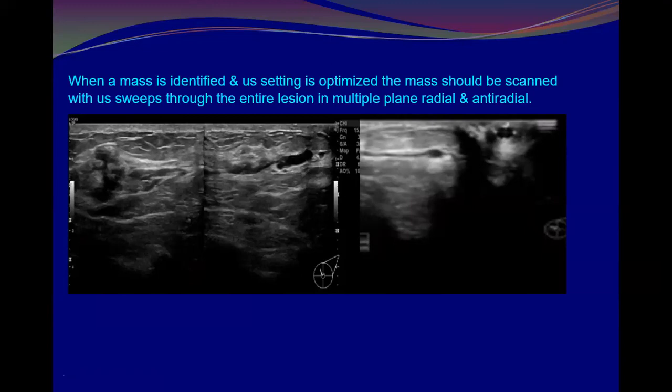But there are other types other than panoramic. We said we have many techniques for extended view. The panoramic, we can use it for measurement. The trapezoid, we can use it for measurement.